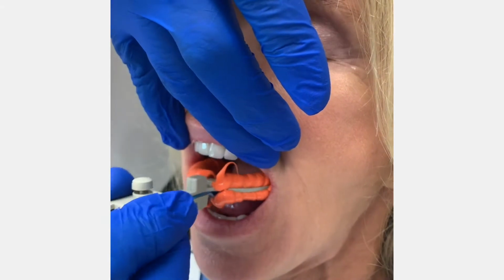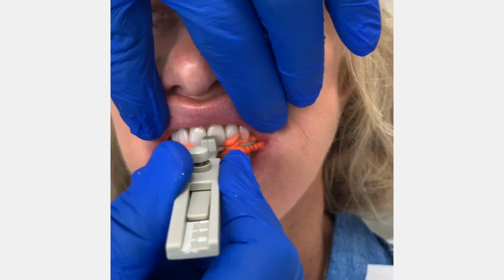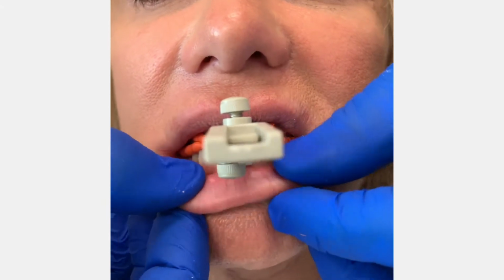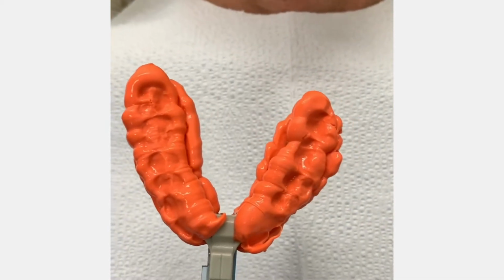After filling the fork, place it into the patient's mouth and center with the upper midline. Have the patient slowly bite into place. While this would look like an excellent bite registration, unfortunately this will have to be redone due to the patient deflecting to the right upon closing. However, notice the detail with DMG's O-Bite bite registration.